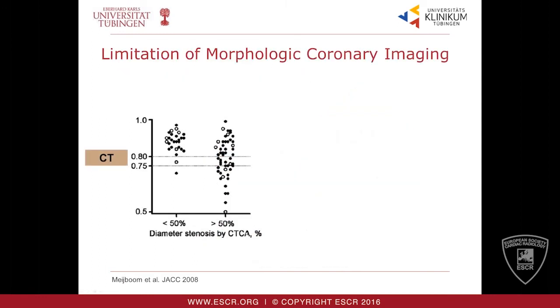But again, before any symptoms occur, before you have any typical ECG changes or functional changes, you would see very early on perfusion abnormalities. So it would be very nice to have an easy and fast scan of perfusion in your diagnostic workup. And the bad news is that CT angio, coronary angio alone, is not performing so nicely.